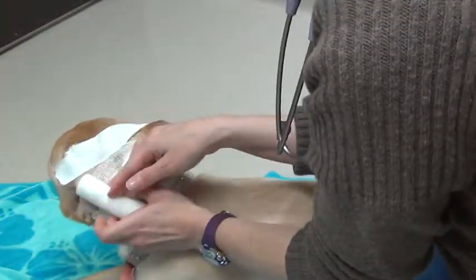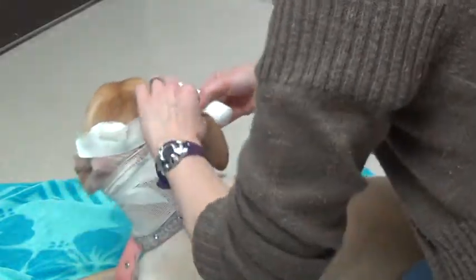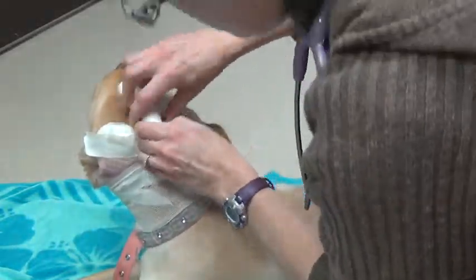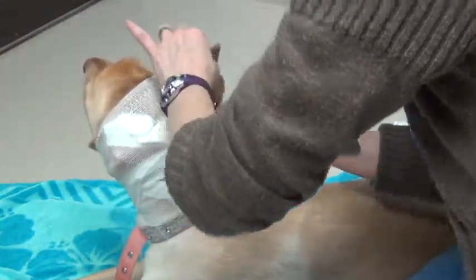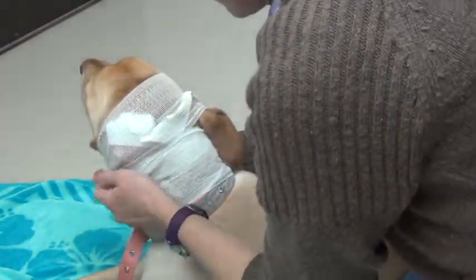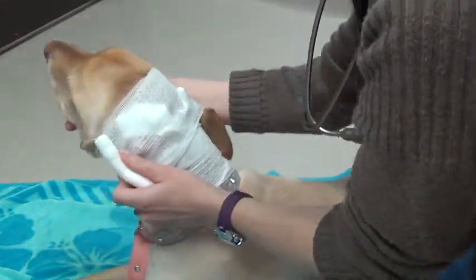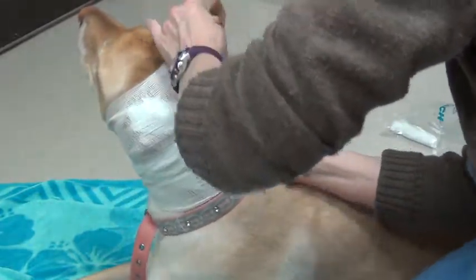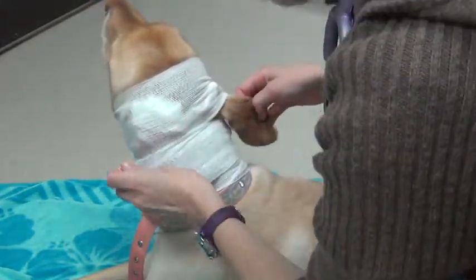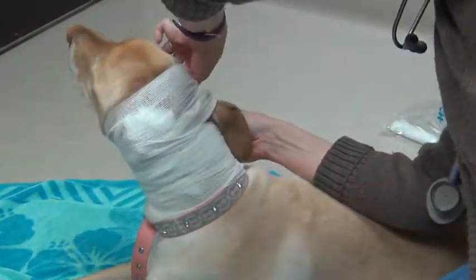Alright, sweet girl. And when we roll over next, we're going to go in front of the other ear. Over here. And under again. Over. And we're also covering our hematoma ear. So it just actually has a swimmer's bonnet on. It's pretty cute. Okay. You can kind of pin this under one of these layers so it'll stay on its own.